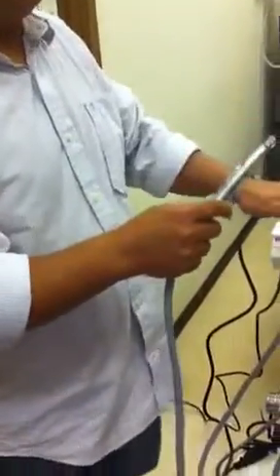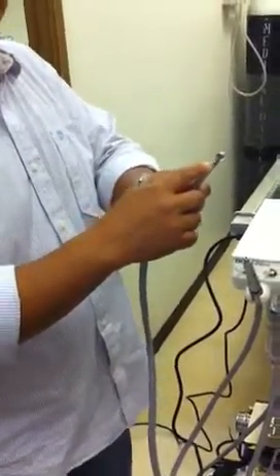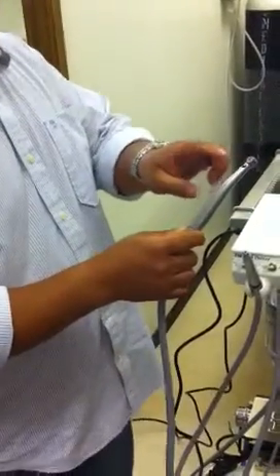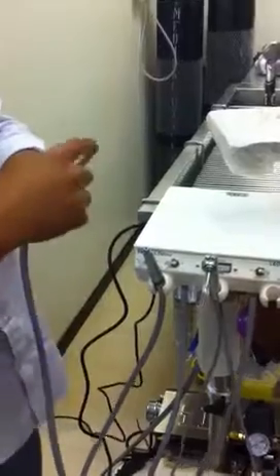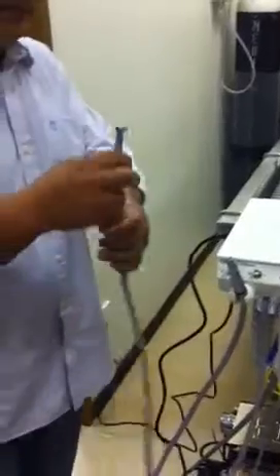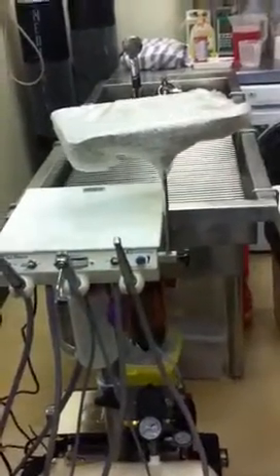This would be the hardest working component on this machine, because this is a turbine with a dynamo that lights this up. If you notice later when I show you, the LED doesn't make use of electricity. When the turbine is driven, it powers up the light. I'll explain later the operation behind it. Any questions so far? Okay, let me just power it on.